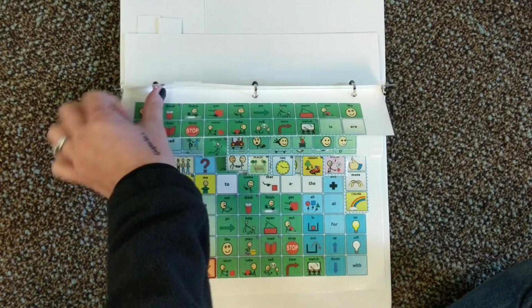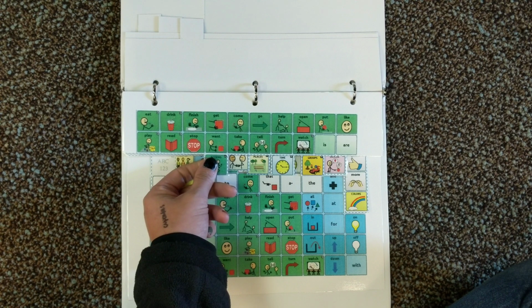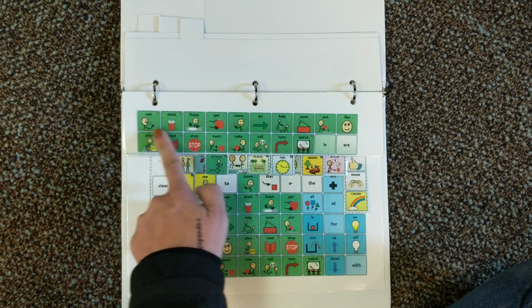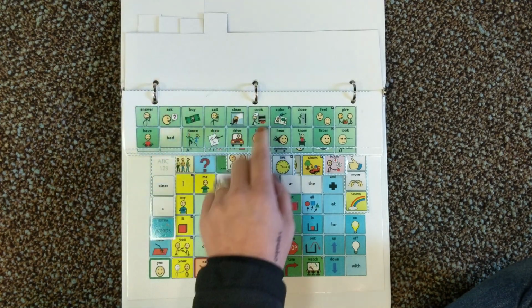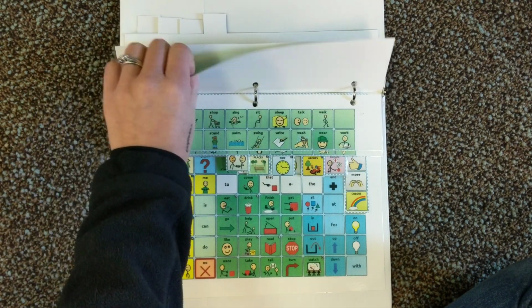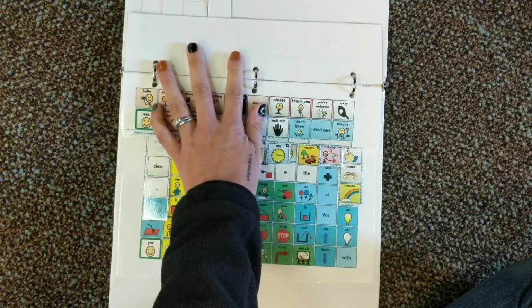If you go to action, there'll be a couple pages of actions. This is probably not all of the actions that are in the device, but a lot of your most used ones. So these are basically the actions that are already on the home page, but then these would be some that are on the next page. And there's like 3 or 4 top pages of actions.